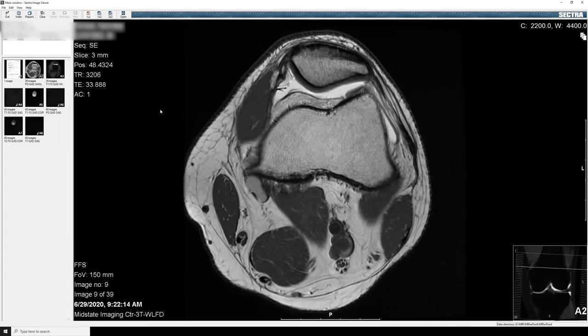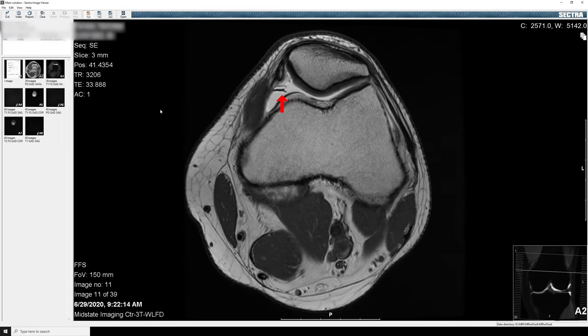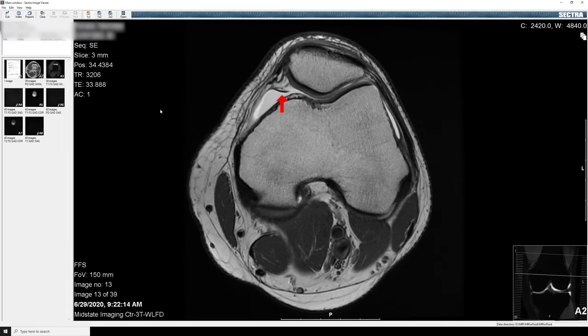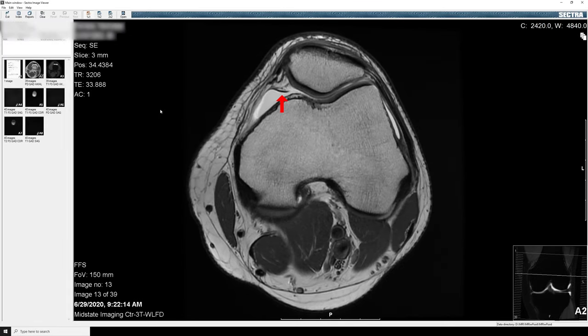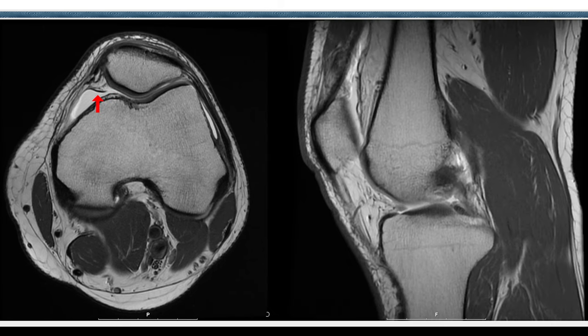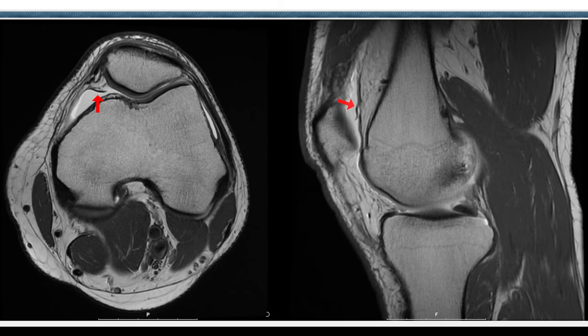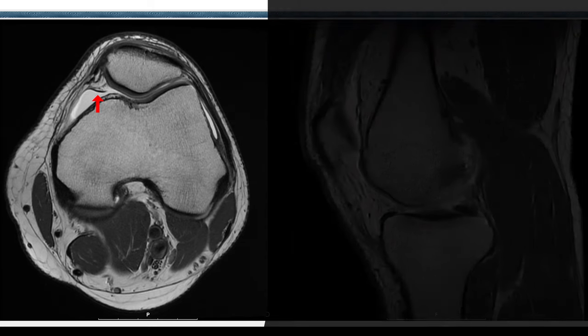So analyzing this 2D MRI here, we do see some findings that appear to be consistent with medial plica. In this case, you can actually see the plica from both views. Where you should be getting a smooth synovial lining around the knee, you're actually getting a protrusion here where it's getting caught underneath the kneecap.